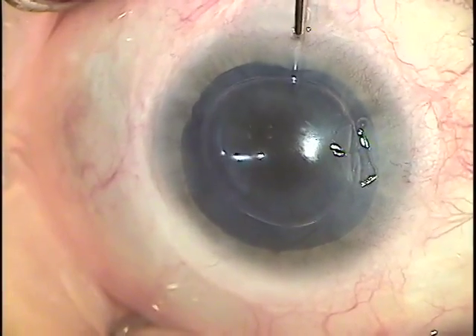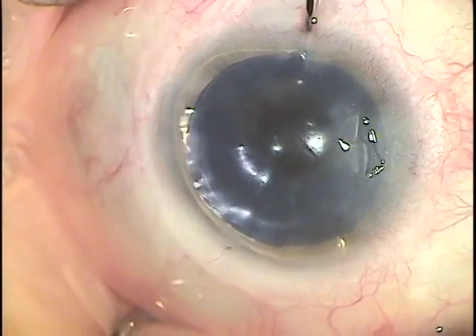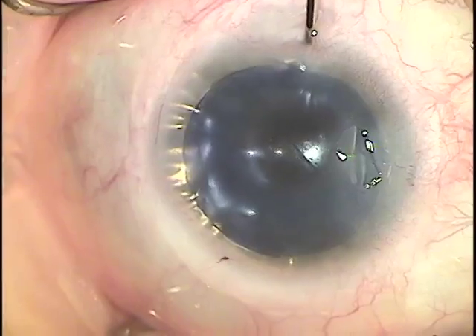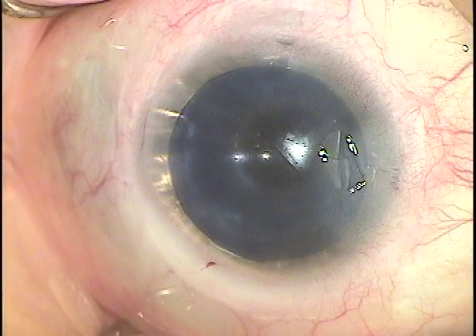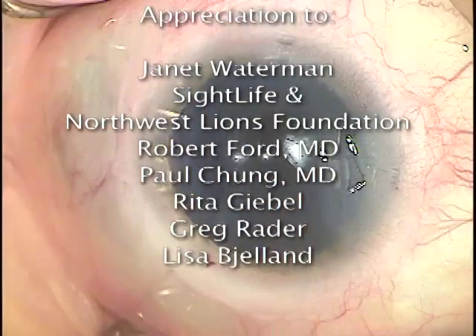Once it's perfectly centered, we go ahead and inflate. And there you have it — a simple cornea transplant using simple materials, nothing expensive and readily available. Thank you.